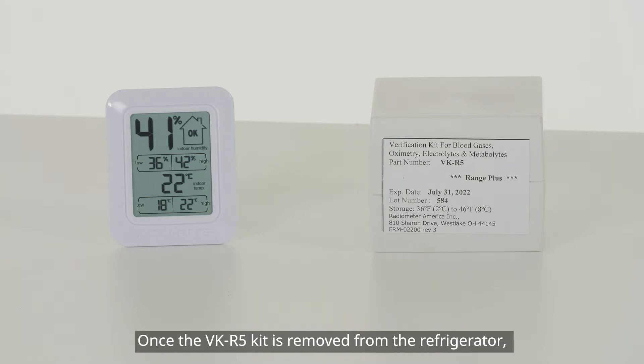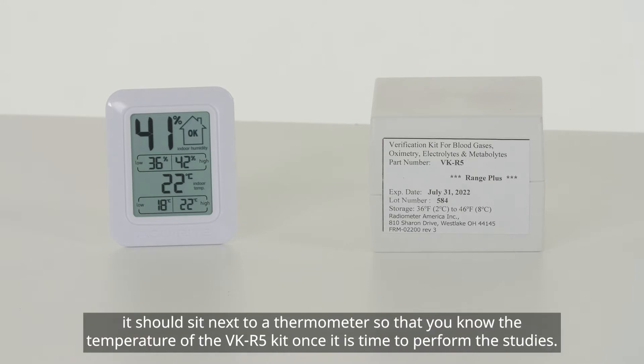Once the VK-R5 kit is removed from the refrigerator, it should sit next to a thermometer so that you know the temperature of the VK-R5 kit once it is time to perform the studies.